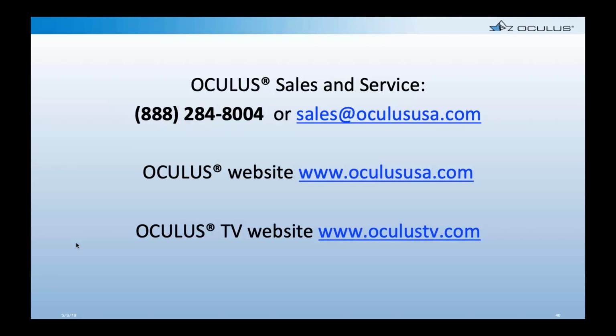Usually just give them something like a -1 or a -1.50. We let them know it's not perfect, but it may just kind of clean things up a little bit for them to function better if they feel like their vision's not acceptable for those first couple of days.